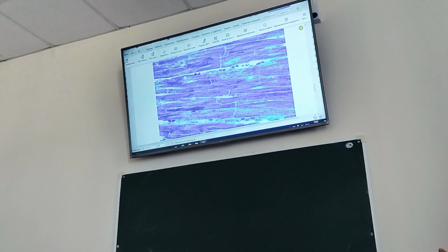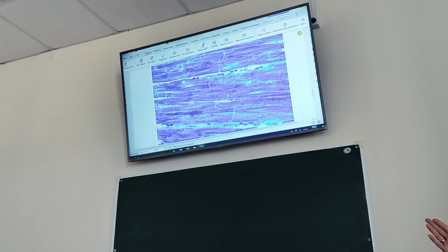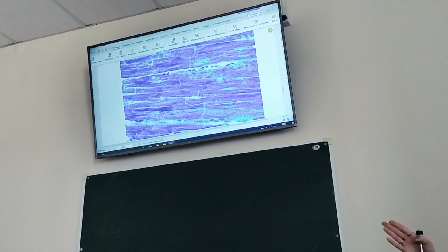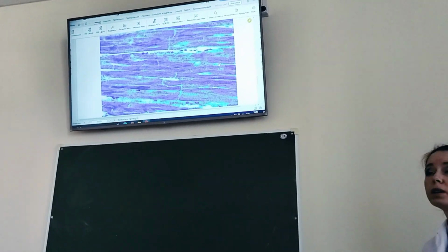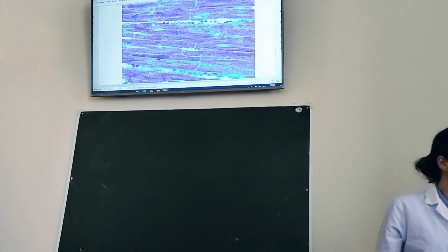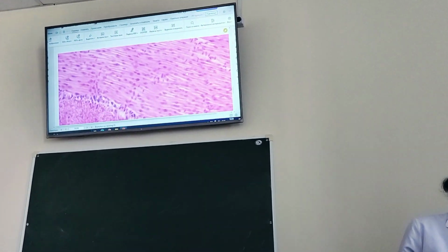So now, a structural functional unit spanning from one intercalated disc to another intercalated disc: a cardiac myocyte, which is branched, mono- or binucleated, organized, we can say, in a three-dimensional network with a centrally located nucleus. Quite enough. A couple of sentences.